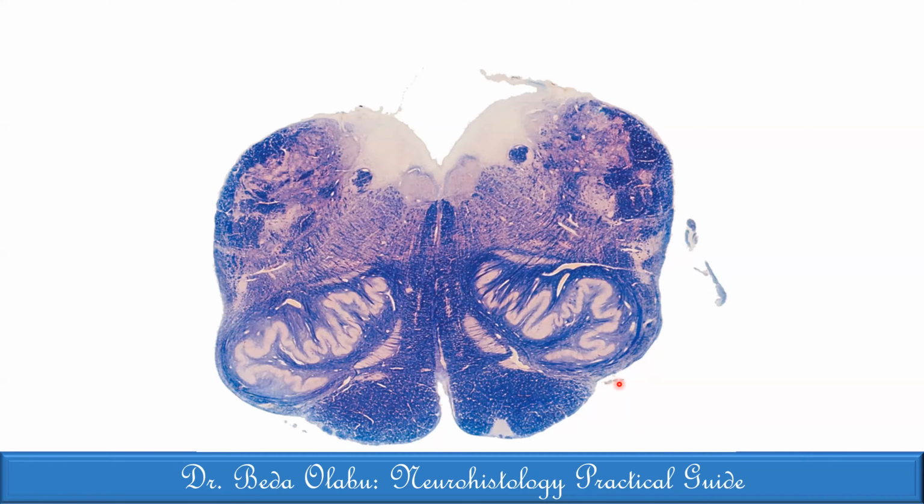So medial to the olives, I think this is the medial lemniscus. Then as you go posteriorly, and to correlate with our theory, the two nuclei. This one in the middle, what will it be? This will be the gracile nucleus. I'm not sure, so I cannot comment.